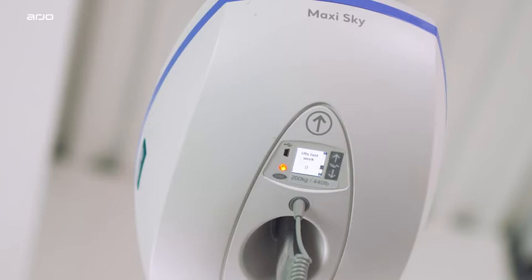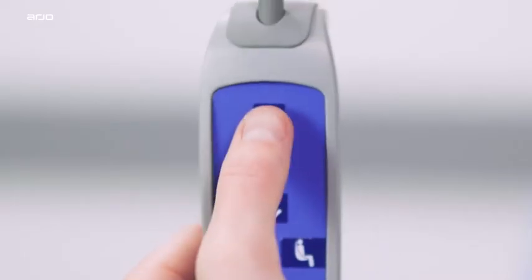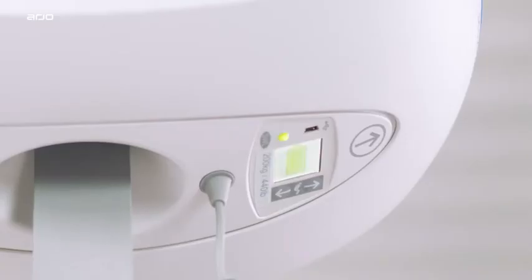The lift will beep twice every 10 seconds when the batteries reach the critical point, less than 5%. The lift awakens every 15 minutes to display low battery messages and goes into sleep mode again after 30 seconds. Pressing any button on the hand control wakes up the lift.